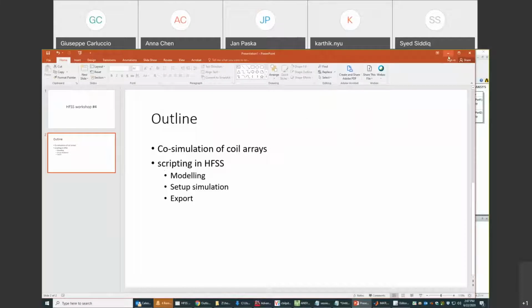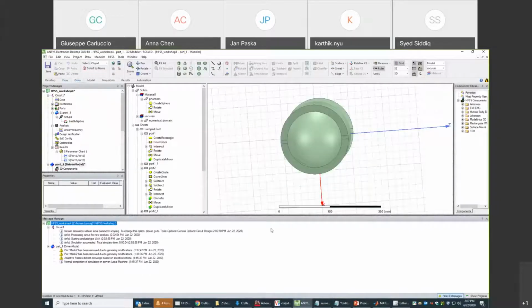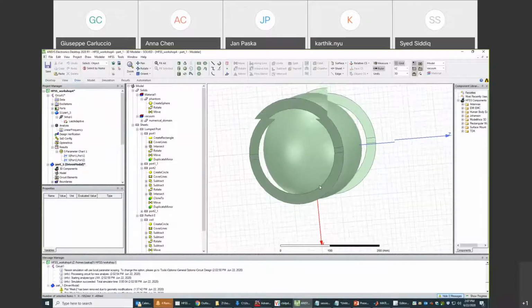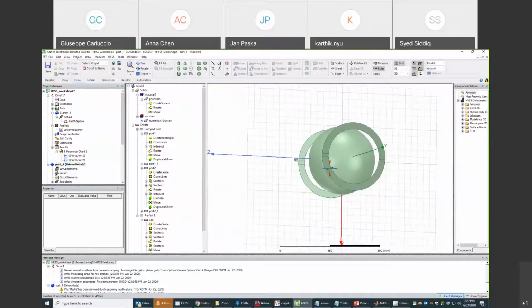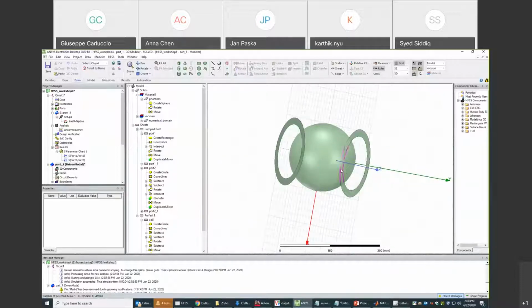So first, co-simulation of coil arrays. I don't want to bore you by modeling here because basically I just took the example that we were working on since the first workshop, which is the single coil. I added another port on the loop itself. So now the loop has two ports. One port is intended to be the feeding port with a matching network, and the other port is intended to have a tuning capacitance. And then I just copied it, and it's a two-port, two-channel array with a phantom in the middle.